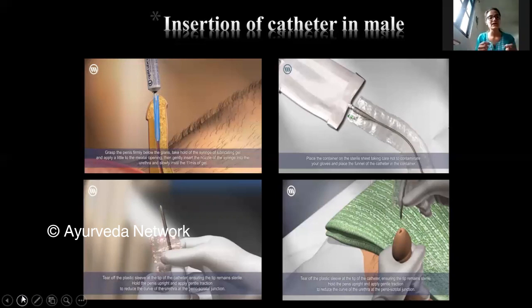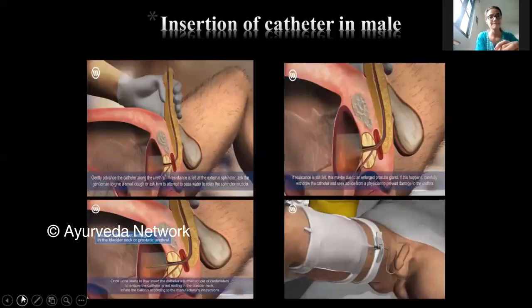Now, after you have done this cleaning and administered the lubricating jelly, and after ensuring that you have connected the catheter to the urobag, you are going to tear off the tip cover. Now you can see it in the third picture. You are never going to touch the tip of the catheter, because that way you can introduce infection to the patient. Touching only the outside plastic, you open up the tip of the catheter, and holding the penis with your non-dominant hand, with your dominant hand you insert the tip of the catheter into the urethra. Next slide. Okay.